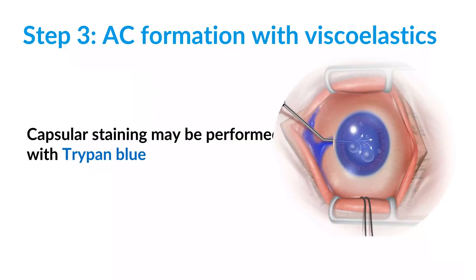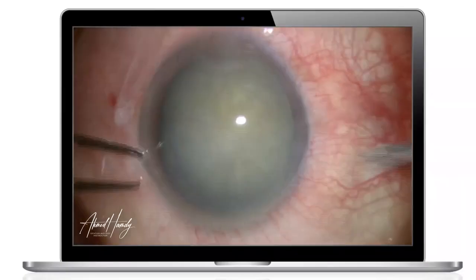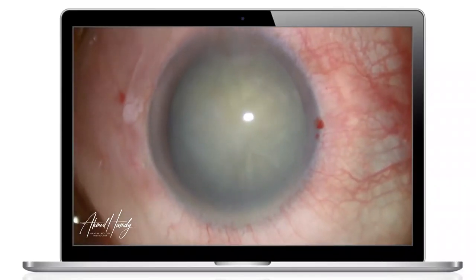Sometimes we need to stain the anterior capsule. This is for cases of dense cataract or white cataract, where we don't see a good red reflex, because red reflex is essential in order to make the capsulorhexis. So in these cases, we stain the capsule with trypan blue stain.